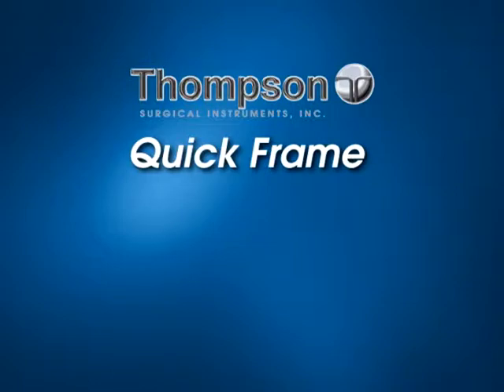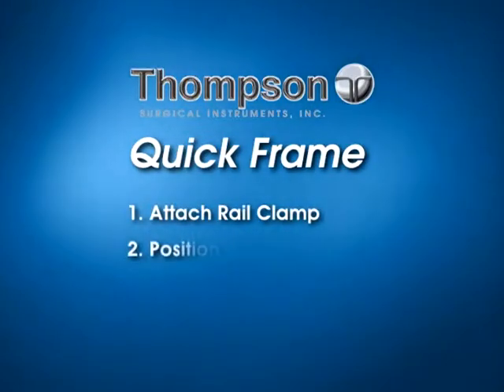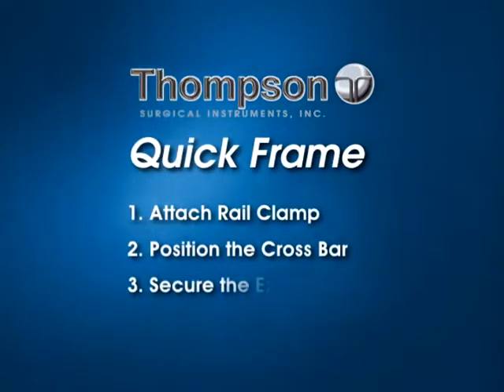The quick frame is set up in three quick steps: attach the rail clamp, position the crossbar, and secure the extension arms.